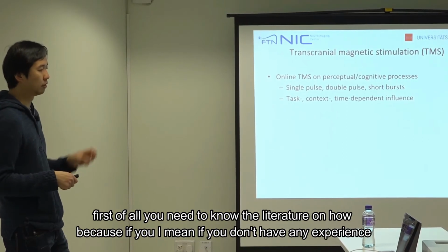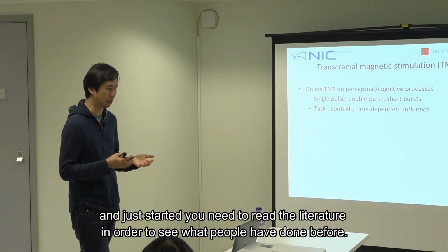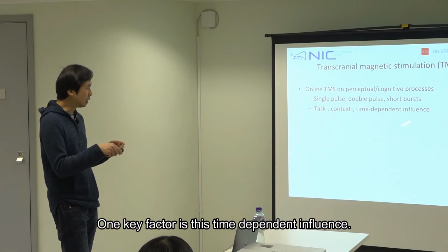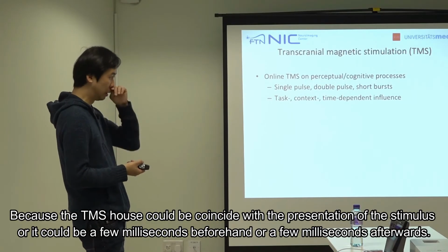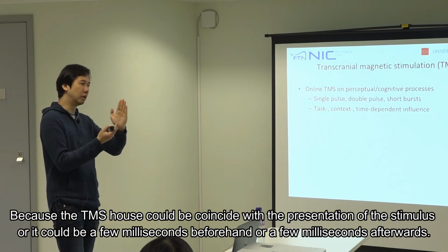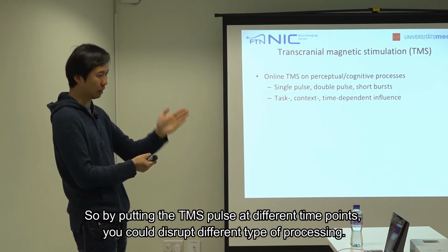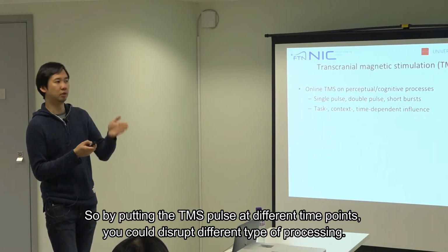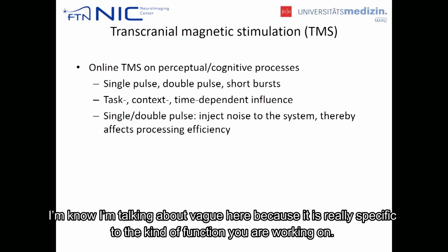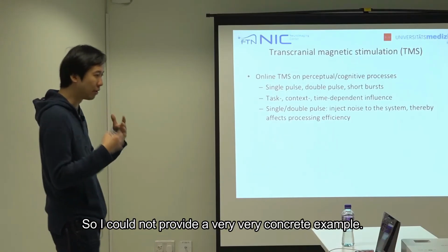So first of all, if you don't have any experience and you just started, you need to read the literature in order to see what people have done before. One key factor is this time-dependent influence, because the TMS pulse could coincide with the presentation of the stimulus, or it could be a few milliseconds beforehand, or a few milliseconds afterwards. So by putting the TMS pulse at different time points, you could disrupt different types of processing. I know I'm talking a bit vague here, because it's really specific to the kind of function you are working on, so I could not provide a very concrete example.